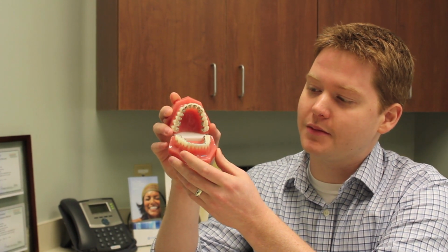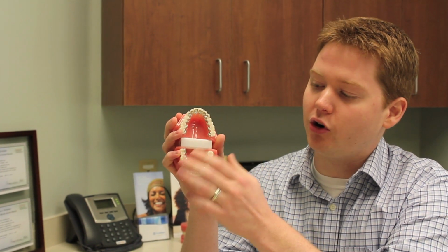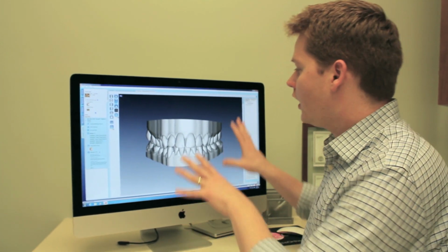The cool thing about them is we make them by taking high quality impressions of your teeth. We send them off to the company. They make the brackets. They're actually custom made for each one of your teeth out of gold, and so they fit real nicely in there like that. And so today we're actually putting some of these on a patient. I wanted to share the experience with you, so we're about to head into the clinic and show you how those work.